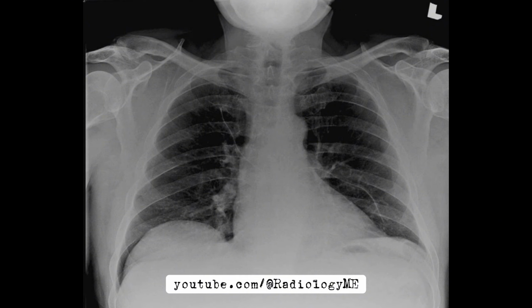In this case, the line was embolized, and the interventional radiologist had to go in and snare the line fragment. Fluoroscopy is often used to visualize the catheter more clearly, and once they've got a hold of it, they can pull it out safely. The good news is that most patients, like this one, recover well after the embolized line is removed. So yeah, this is a great case that highlights the importance of reviewing imaging thoroughly and acting quickly when complications arise, especially in patients who are undergoing treatments like chemotherapy. Radiology not only helps in diagnosis, but also guides management in critical situations like this.